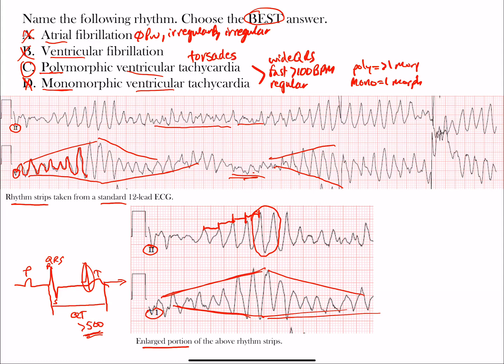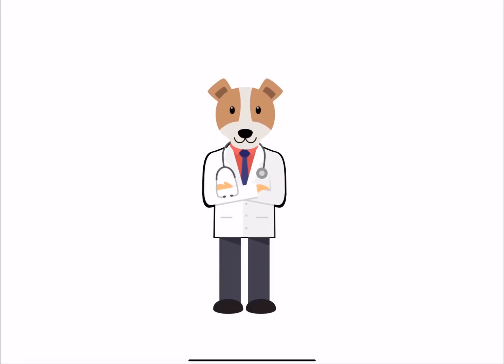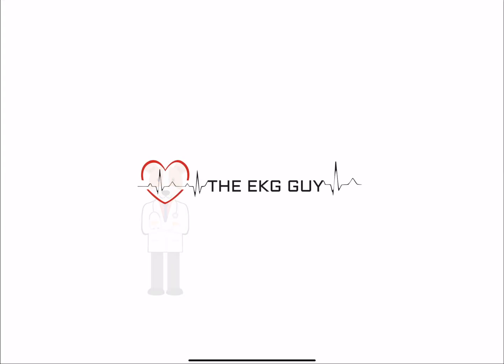To recap: atrial fibrillation is not correct — we have no P waves and no normal conduction down through the ventricles. This is a form of V-tach, not ventricular fibrillation, although some areas may look like V-fib. Choosing the best answer, it's V-tach — not monomorphic because it has more than one morphology. Our best choice is polymorphic ventricular tachycardia, or torsades de pointes. That's the end of this lecture; I hope you learned something and enjoyed it.